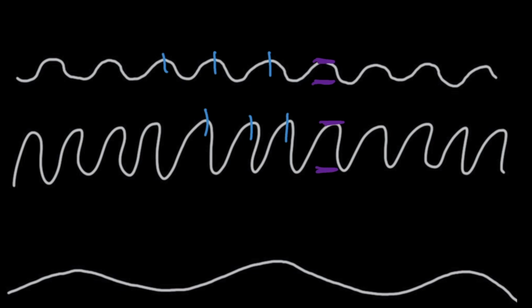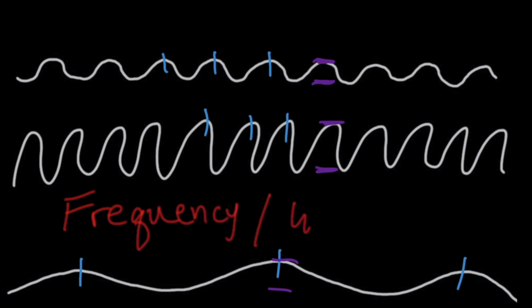And the bottom wave has an even longer wavelength, therefore a lower frequency, and it also has a lower amplitude than both the above waves. So therefore, it will be lower and quieter. If you look at this, you'll notice a key concept: frequency is inversely proportional to wavelength. Meaning, the bigger the wavelength, the lower the frequency, and the smaller the wavelength, the higher the frequency.